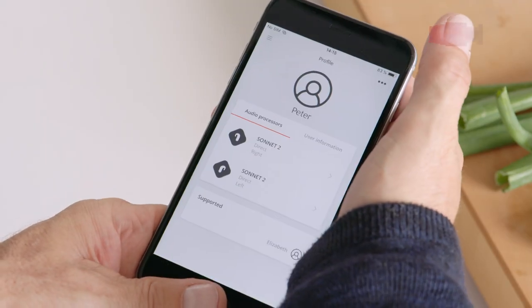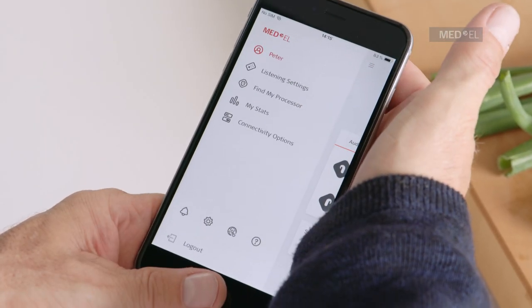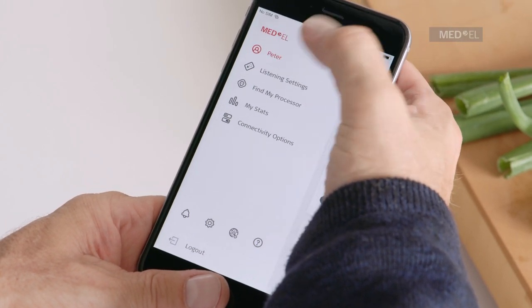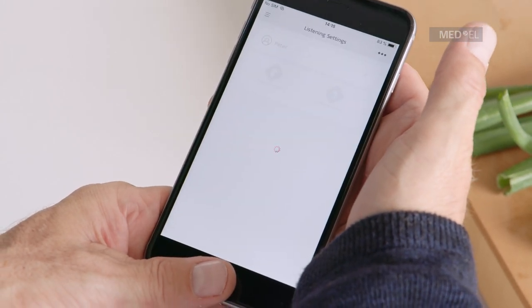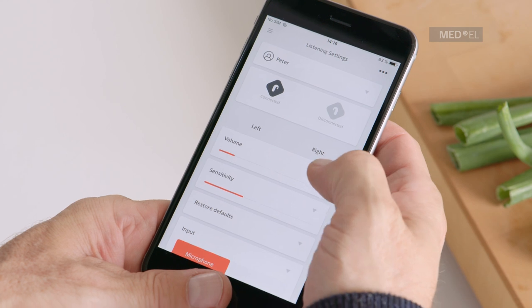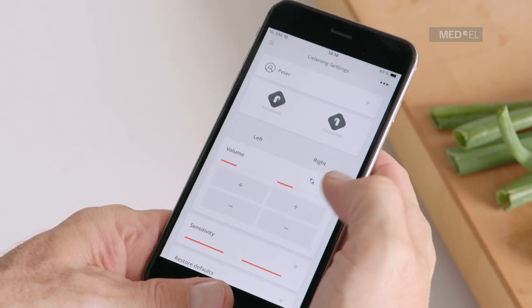To change your settings on your audio processor, select Listening Settings from the menu. On this page, you can control settings such as volume or adjust the sensitivity.